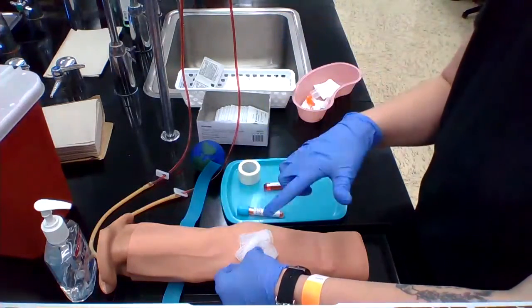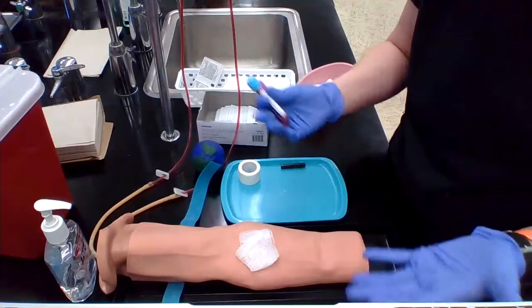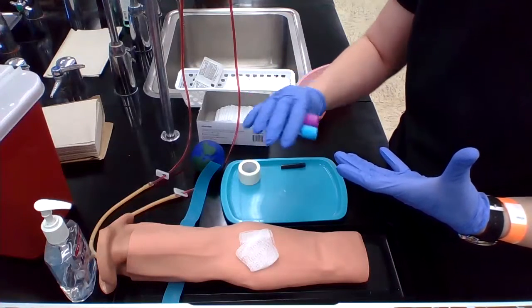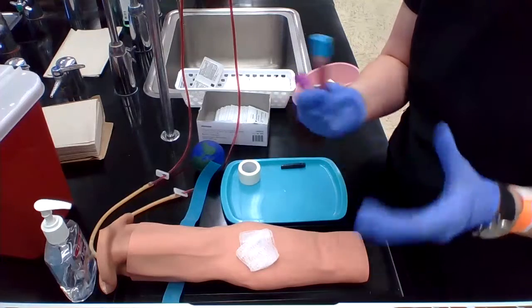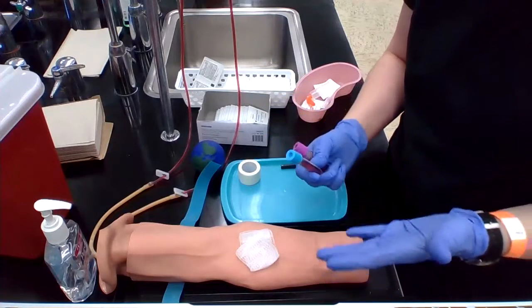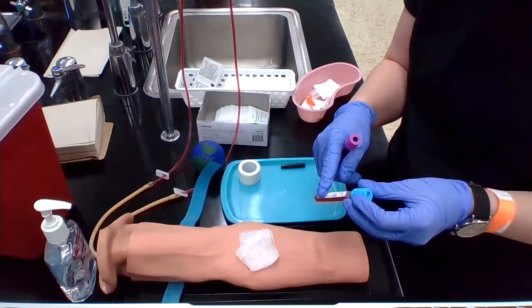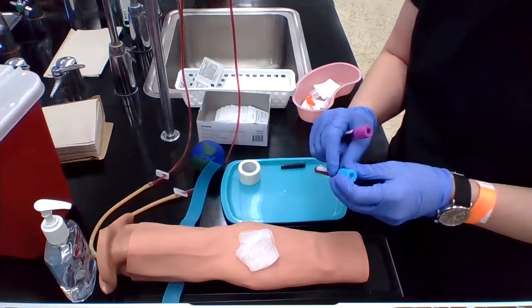Once the needle is out, your first job is to put the safety on because this is dangerous. Discard it in the sharps container right away. Ask your patient to hold the gauze, and while they're holding it with pressure, check in on them — ask how they're doing, how they're feeling, if they're feeling lightheaded. Gently invert your tubes about eight times — don't shake them because that can break up the cells. Then label your tubes. Don't label before the draw — label afterwards — because if the tube has no vacuum and you get no blood, or you have to stop mid-draw for any reason, you may need to throw the tube away. If you have preprinted labels, you only have a certain number for that patient, so you don't want to waste them.